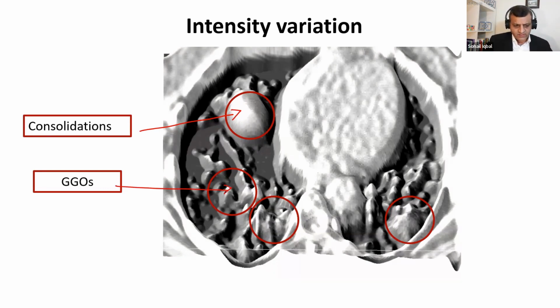But one thing is very apparent in the intensity plot: there are saddle points at each and every region of the ground glass opacities. So that's, once again, the main observation in the intensity plot. The consolidations are solid, big mountains, and the GGOs are the saddle points.